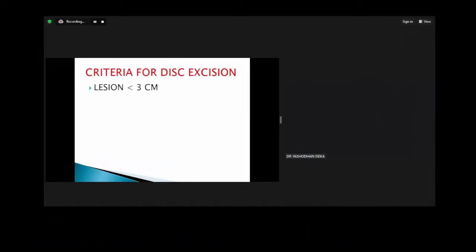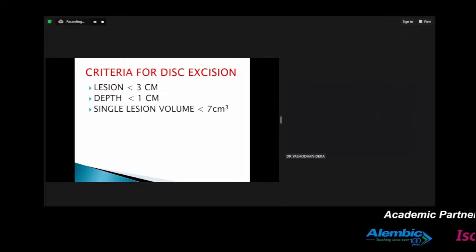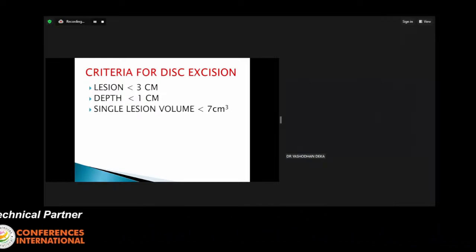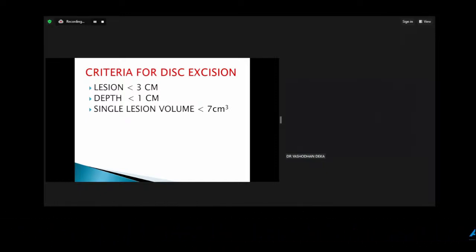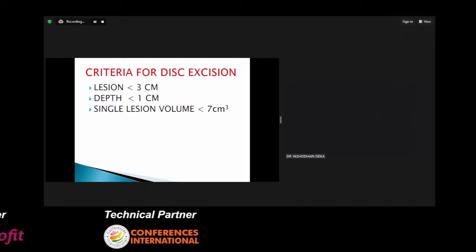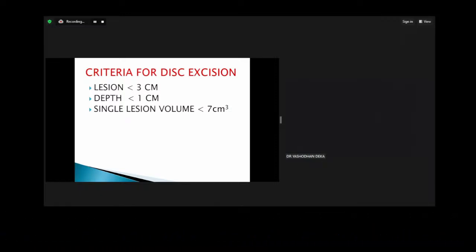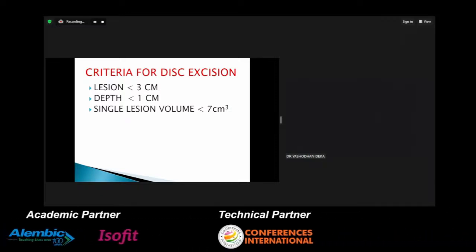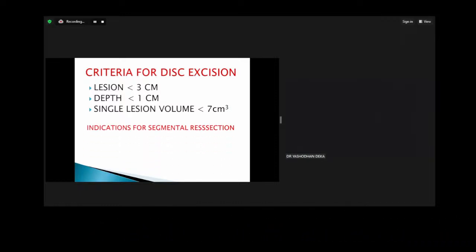When the lesion is less than 3 centimeters for a discoid, depth is less than 1 centimeter, and a single lesion volume of less than 7 centimeter cube. Why does volume in centimeter matter? Because when we use a circular stapler for a discoid excision, there are different sizes from 29 to 31 to 33, and we should know what volume of tissue they can actually retract. Only then will we be able to pick the correct size.